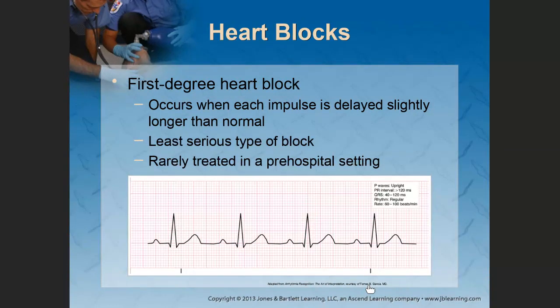So the electrical activity of the heart is fine. The blood is just not moving, whether it is being caused by a pulmonary embolus or a coronary thrombus. Something is blocking blood flow within the heart. So that's the last one, pulseless electrical activity. So you have PEA and you have asystole, you have your VTAC and your VFib. You have your sinus bradycardia, sinus tachycardia, normal sinus rhythms. These are the rhythms you will be expected to know when you come for your face-to-face session.